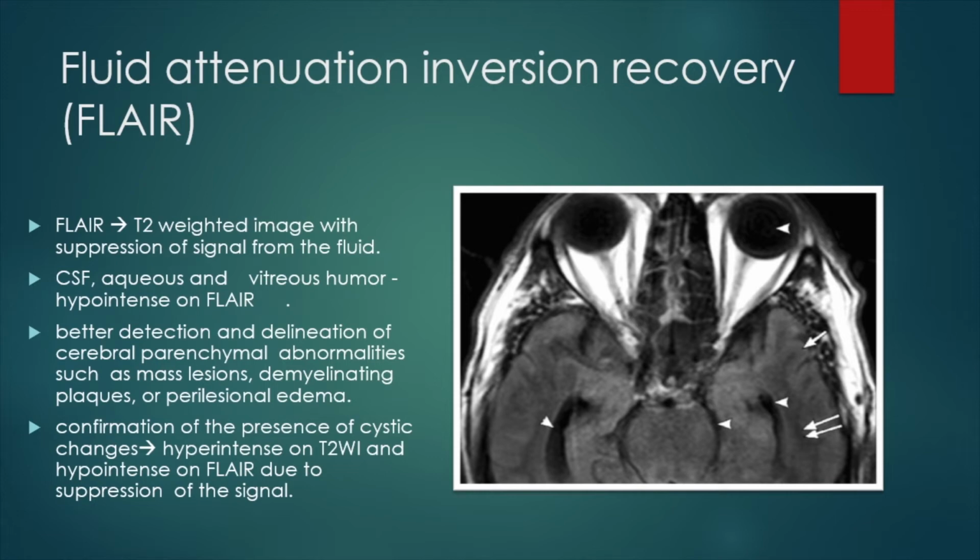Because of this, we would get a better detection and delineation of cerebral parenchymal abnormalities such as mass lesions, demyelinating plaques, or perilesional edema. It's also useful in confirmation of the presence of cystic changes.